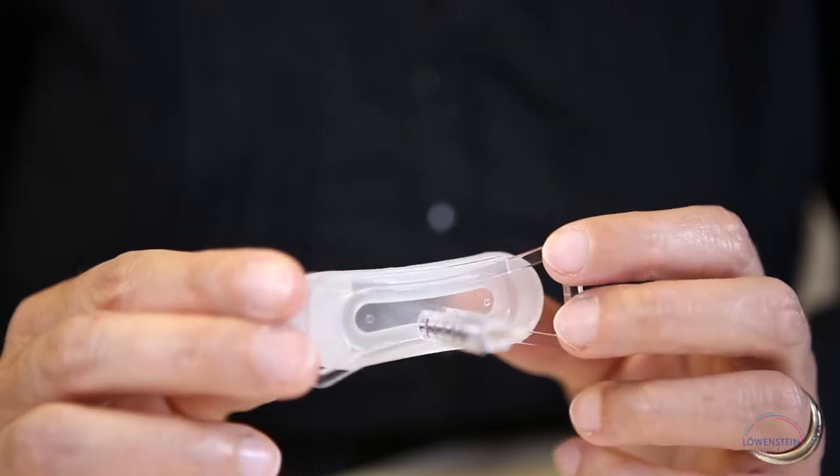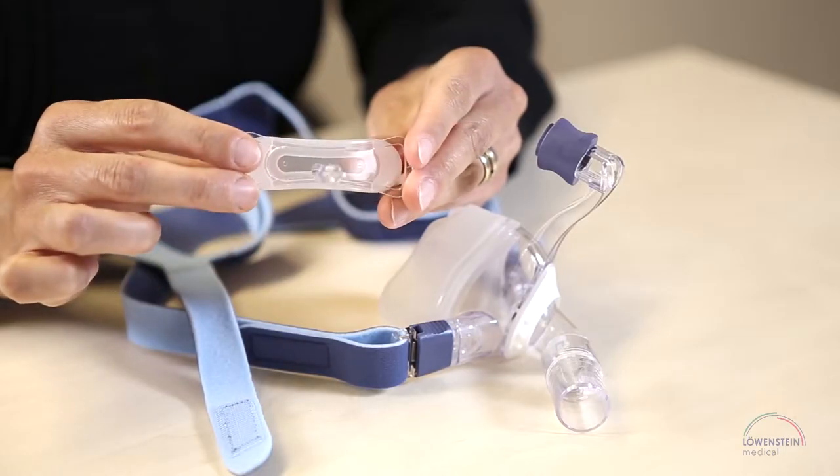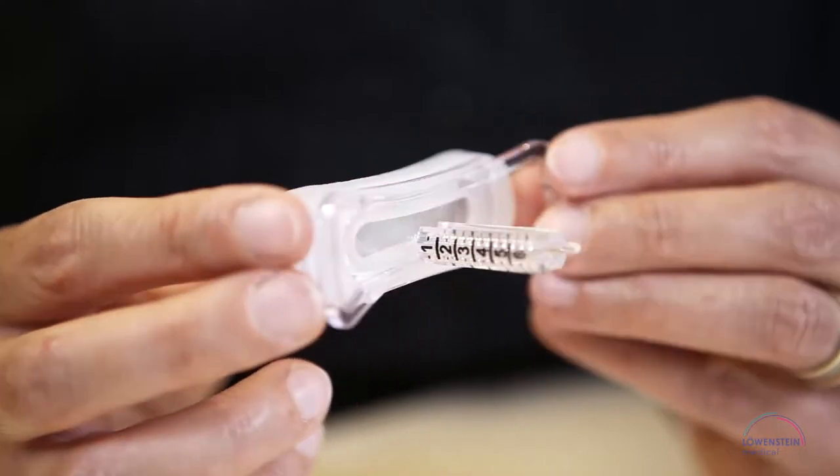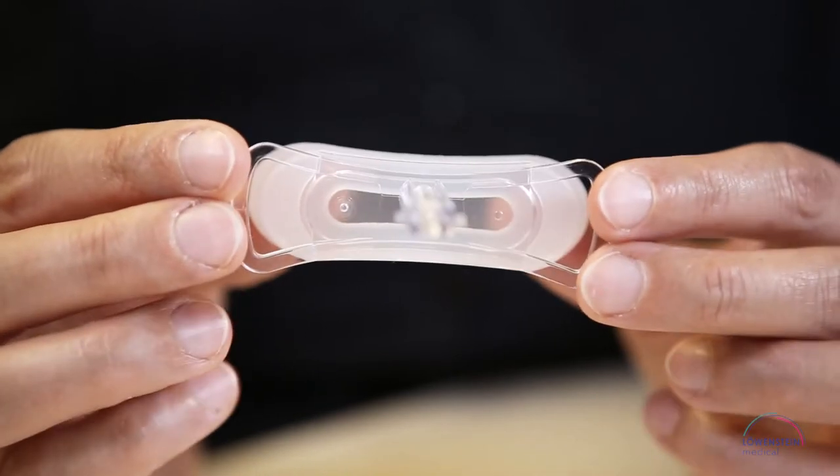You can see that the horizontal bar on the support is not centered on the mask body. Turn the forehead support 180 degrees. The numbers are now on the other side.